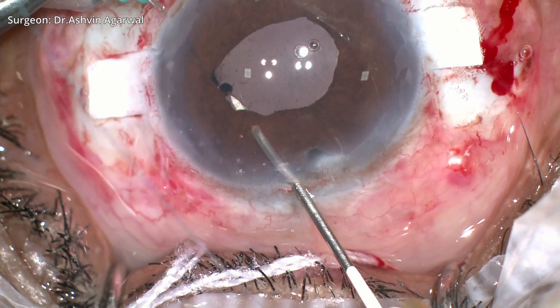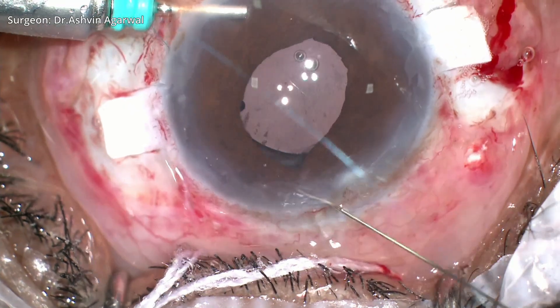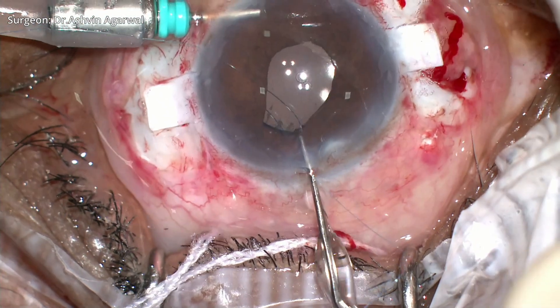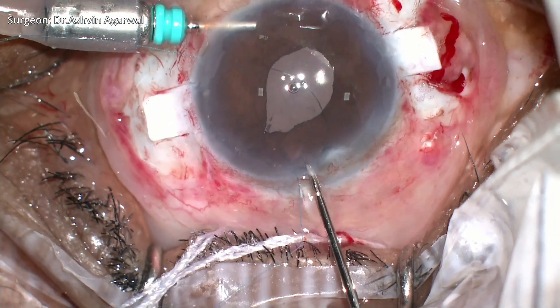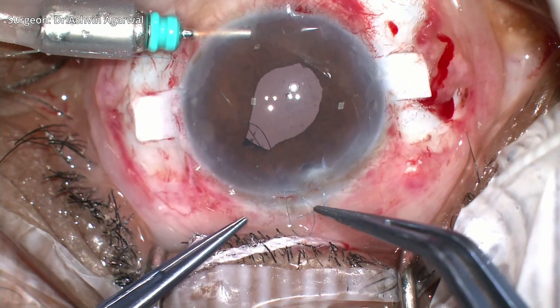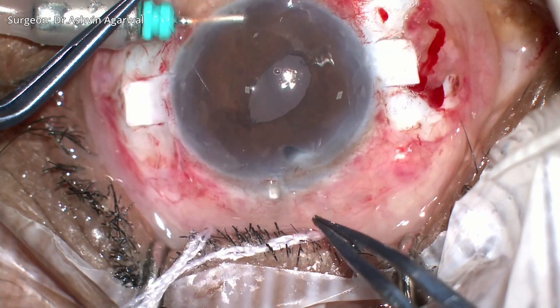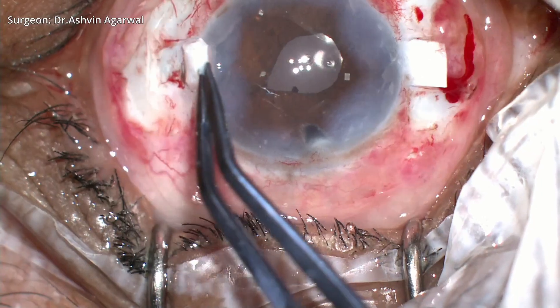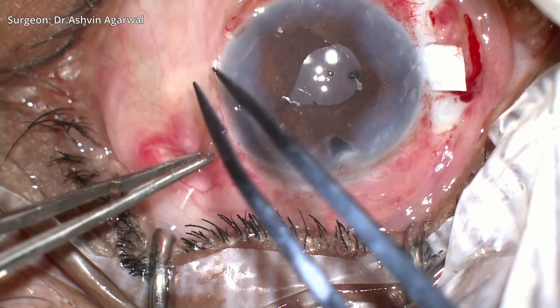A 10-0 polypropylene suture is passed through the proximal iris and railroaded through a 26-gauge needle which is passed through the distal end of the iris. A loop of the suture is then brought out through the distal incision, and the end of the suture is passed into the loop four times. The two external ends are then pulled away from each other, thereby bringing the iris into apposition.